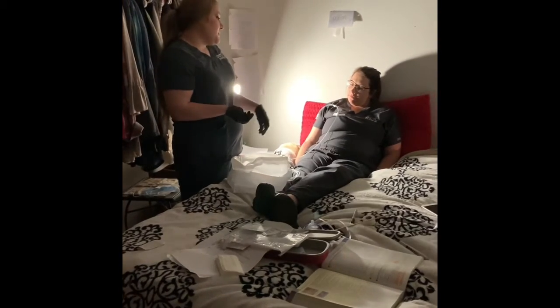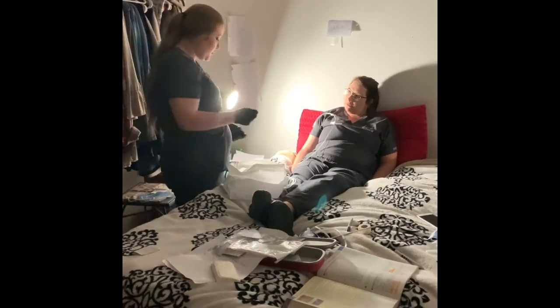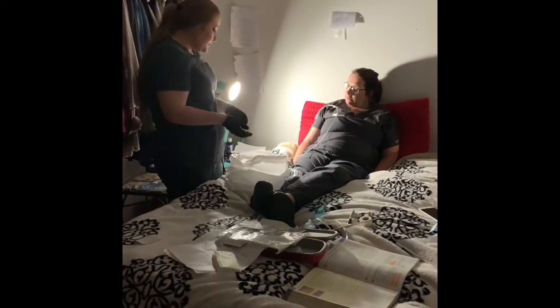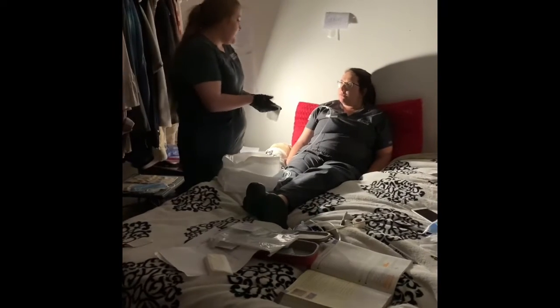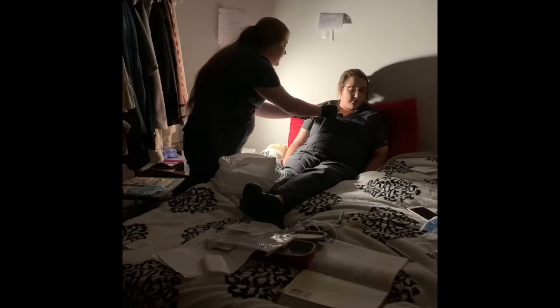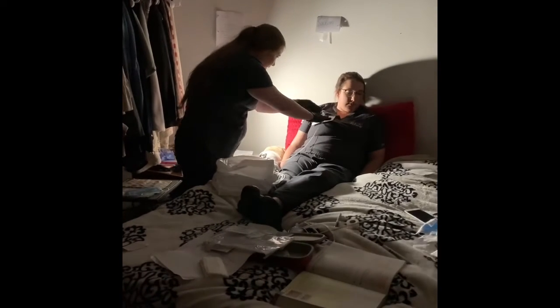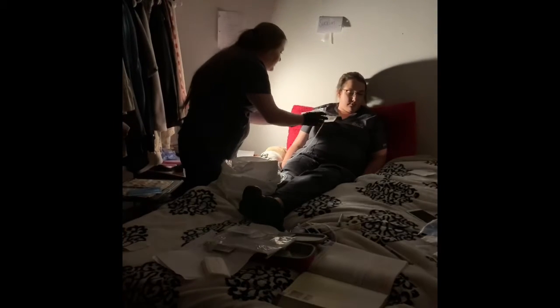Once it has been completely dried, I would then repeat the same process with the iodine or the betadine, whatever I had on hand. Once that has been completed, I would then get my bandage, which would have adhesive to it. I would then put it back on top of the central line. Once that had been applied, I would get my clear cover.